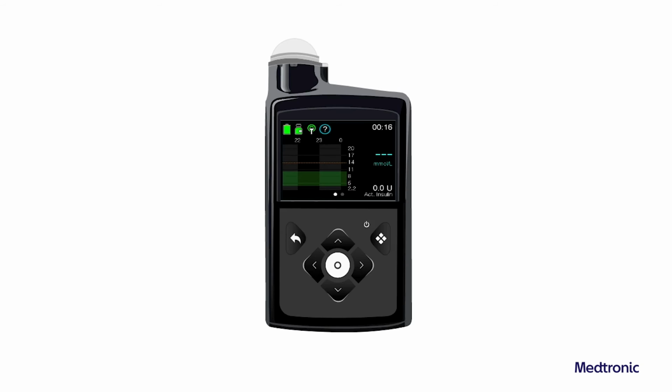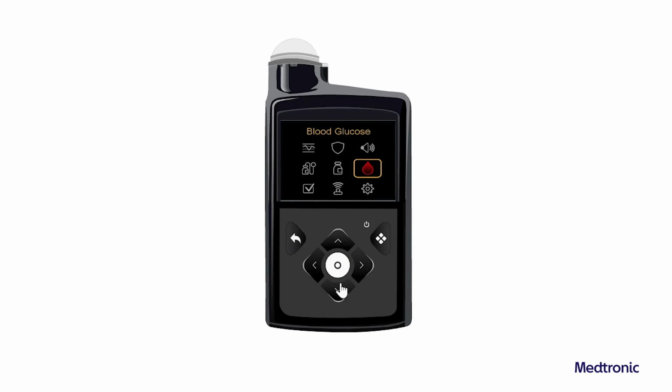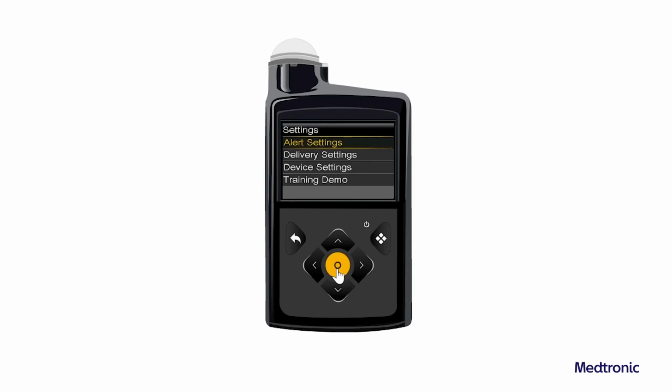Setting up the low SG settings. To set up the low SG settings, from the home screen, press Select and then select Settings. Select Alert Settings and then select Low Alert. The low setup screen appears.